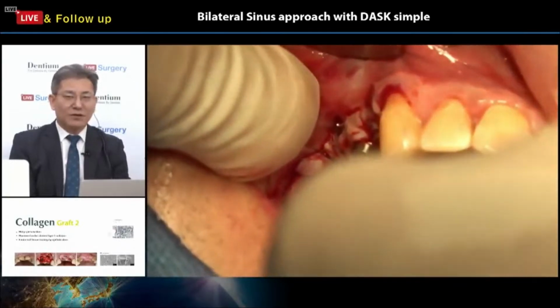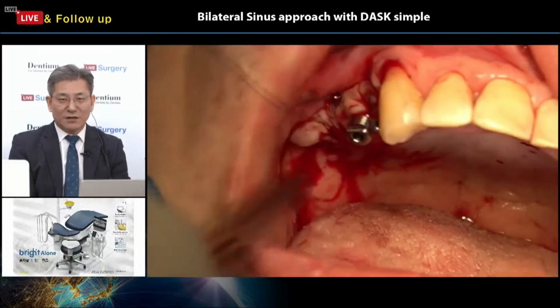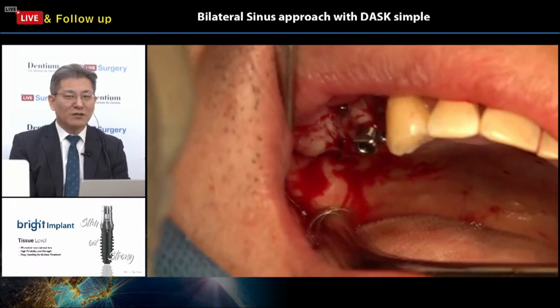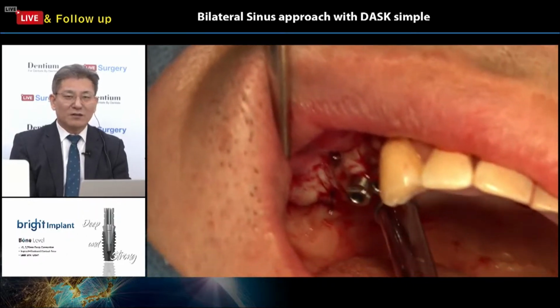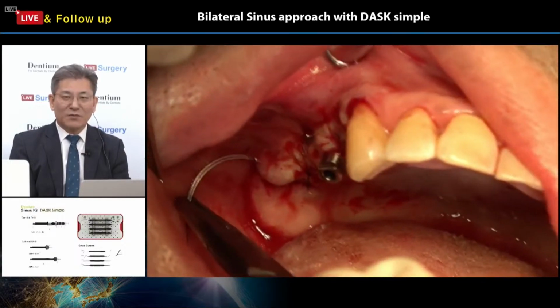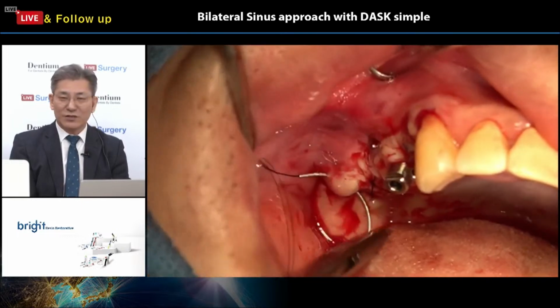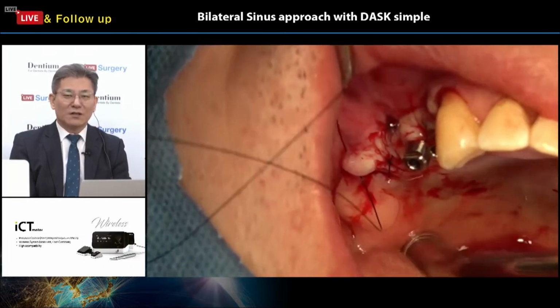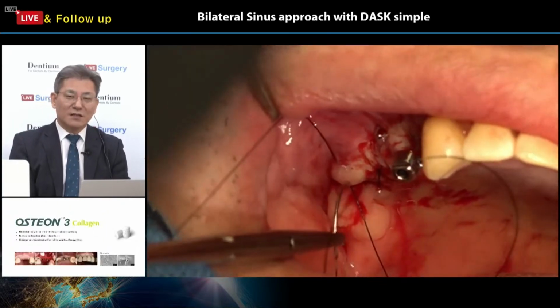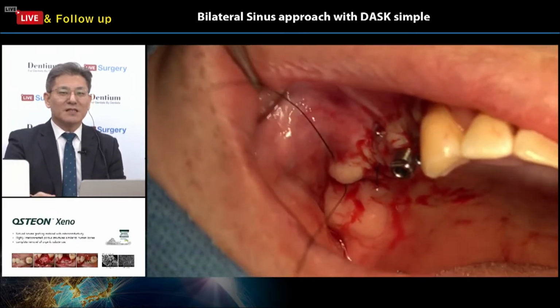And all the procedures look simple, even though the remnant bone of the maxillary posterior areas is a small bone volume, under 3 millimeters. However, Dr. Chung has done it, and it looks like a simple procedure. So how can he achieve this kind of simple procedure? First, experience. Second, skill. Third, maybe the kit and the good implant system.